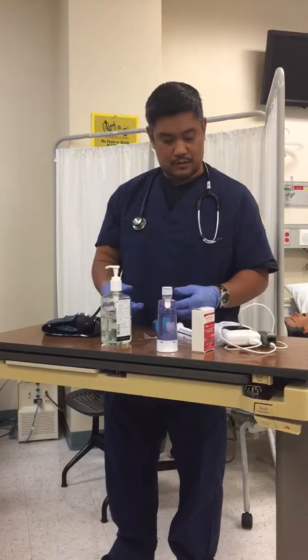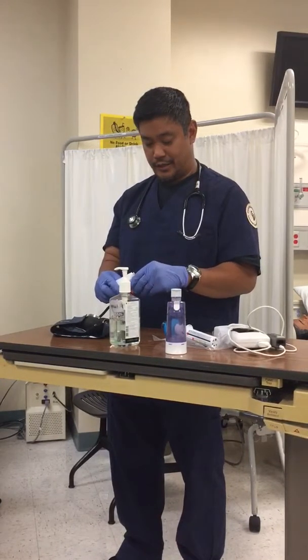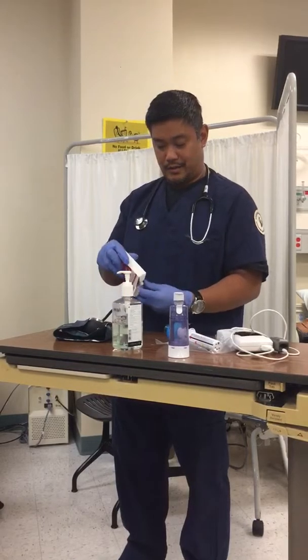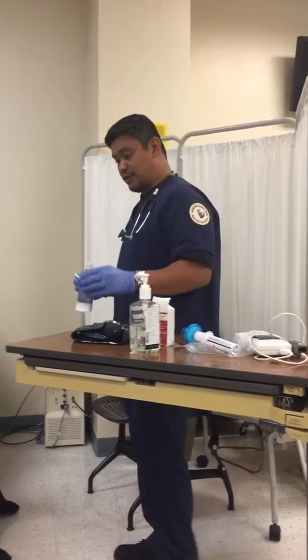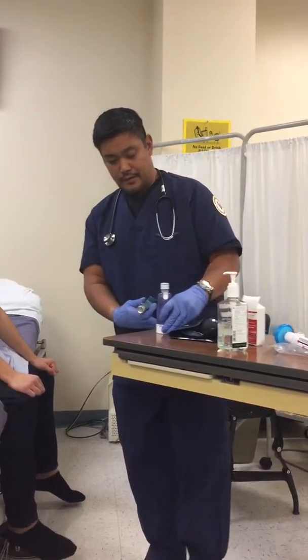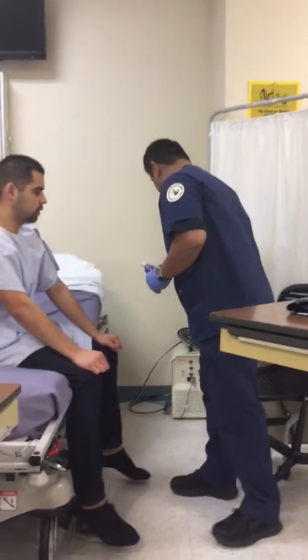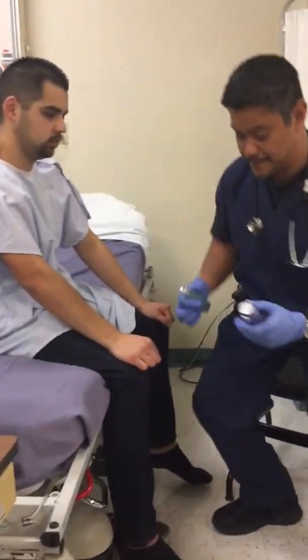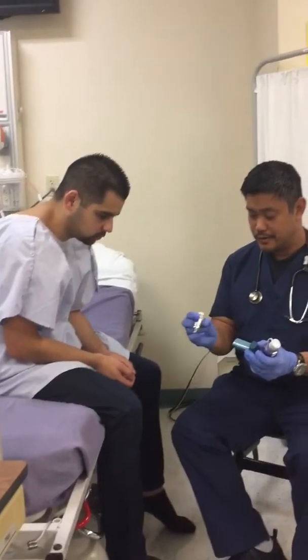Okay, so let's go ahead and start with the medication here. So we've got your inhaler, your metered dose inhaler. And we got an accessory device called a spacer next to you here. The medication here is albuterol.